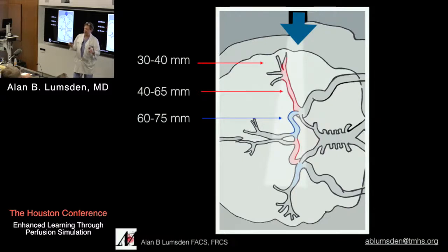When embolization occurs, again, let's do the lawyer thing. Is no embolization better than embolization? This is the problem: nobody can argue that having holes in your head after this is a good thing. It's a bloody awful thing. The good news about TAVR is that by and large these patients feel better. They got a new valve, you've kind of uncorked the damn outflow tract, so they feel better. So all of the cerebral stuff kind of gets obfuscated a little bit in trying to figure it out.